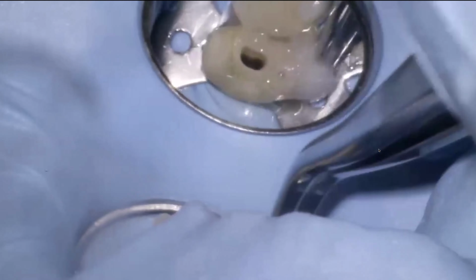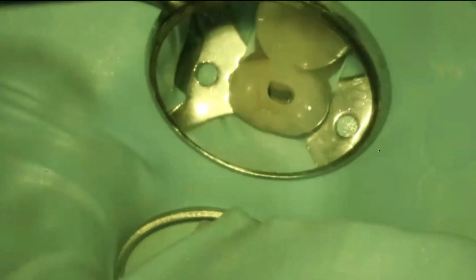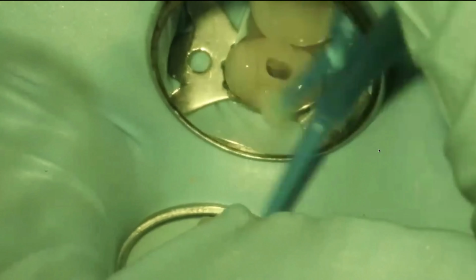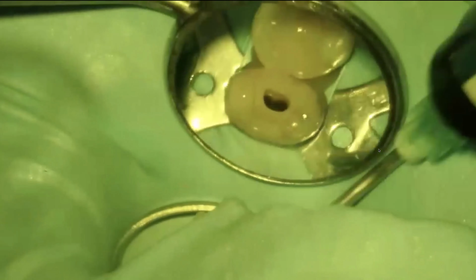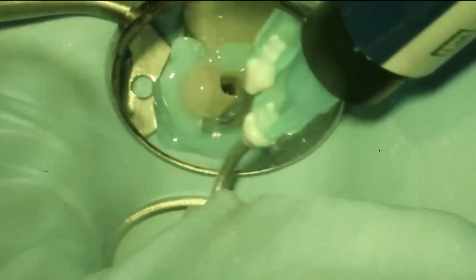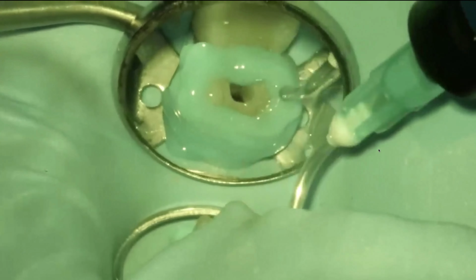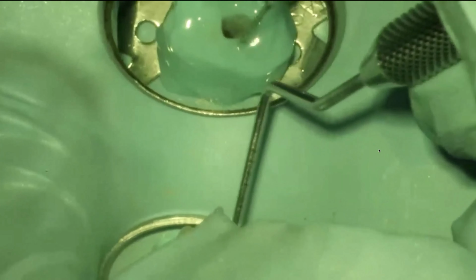Same steps here. We're using alcohol just to clean off the tooth and dry it to make sure it's really, really dry. In this case, I'm putting a little bit of bonding agent just to give a little bit of extra adherence to the platform. And now, the same technique. I'm just going to smear it around. I like to do a full buildup on teeth that have interproximal restorations, just in case there's something I missed, a little bit of leakage or whatever. I don't want to risk not having a perfect seal.